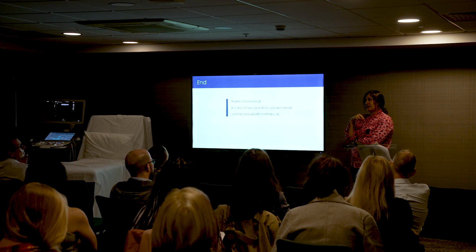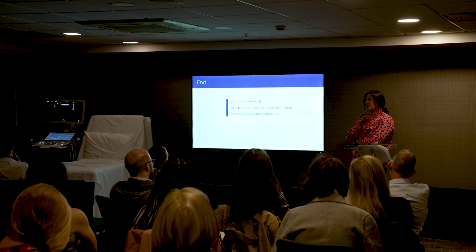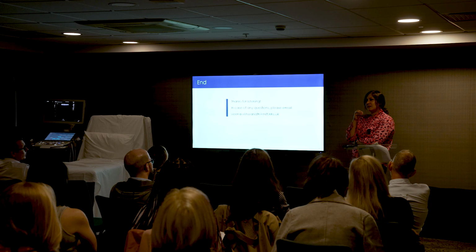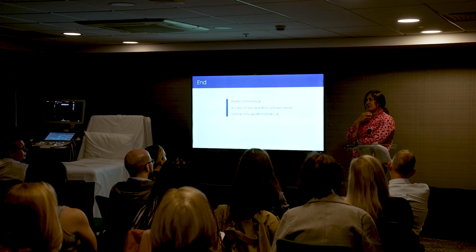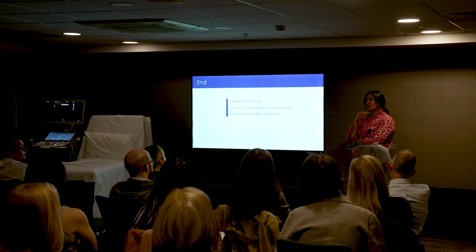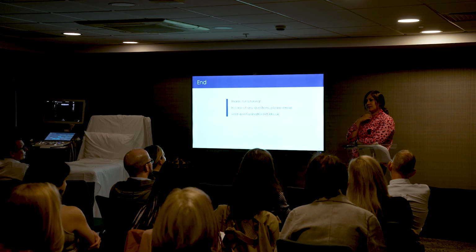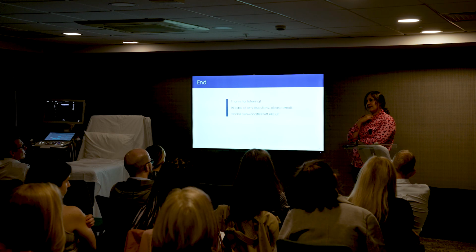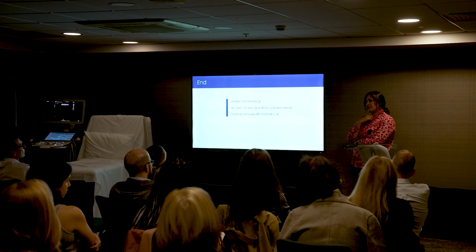With microcalcification, the presence of acoustic shadowing is not always present, but anything that appears very punctate and echogenic, I would be concerned, and I would definitely do an FNA of it. I think when I see definite acoustic shadowing is when I call it definite microcalcification, but anything where I don't see comet tail or acoustic shadowing, I would call this equivocal echogenic foci, and it is actually something that's debated a lot amongst radiologists. We often get second opinions amongst ourselves, but yeah, they can be tricky, definitely.